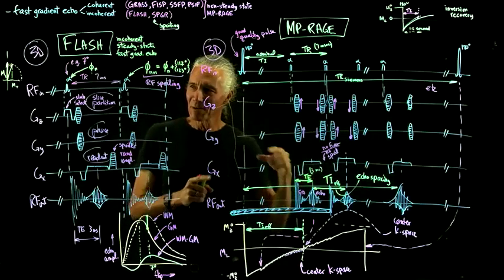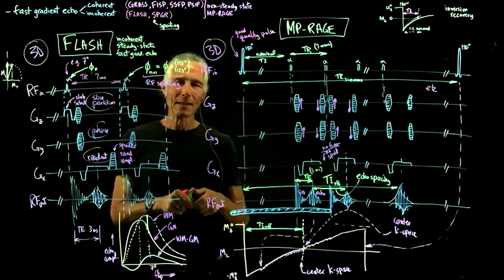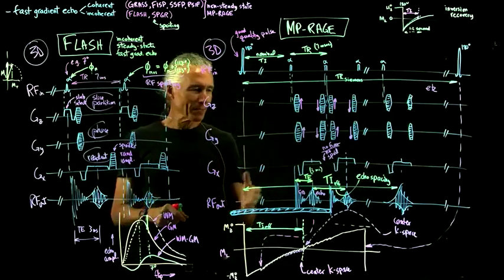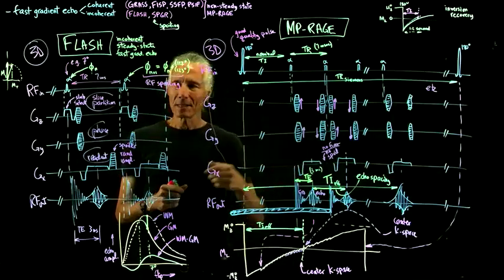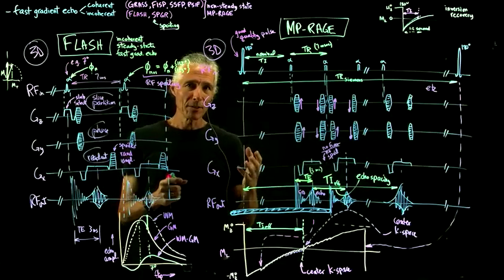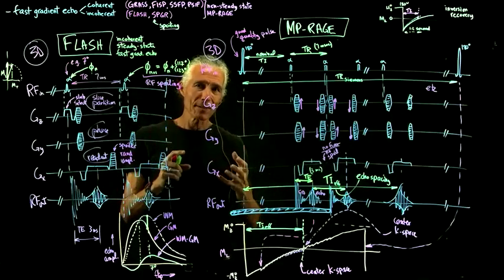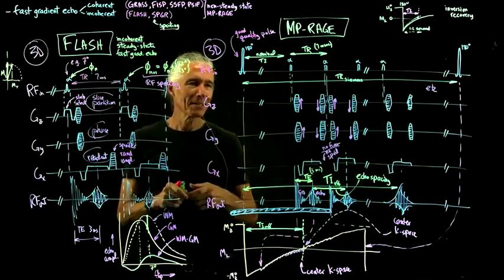And then let's rename everything differently from the other sequences. So, but why did we do this? Because the gray-white contrast is really good, and so this is basically a standard sequence that you use if you wanted to reconstruct the cortical surface using our cortical surface software. This is the sequence you would use.